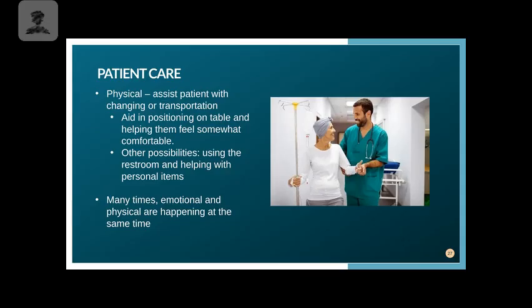So when you raise your patient up into the machine, I'm only 5 foot tall, so they're at like my shoulder level. And so with that, when I have to roll a patient towards the other side, sometimes I have to get up on my tiptoes in order to roll them or slide them a little bit different way. It still works for me. So even if you're as short as I am, that's all right. But definitely it takes a toll on your body after all of the maneuvering around.